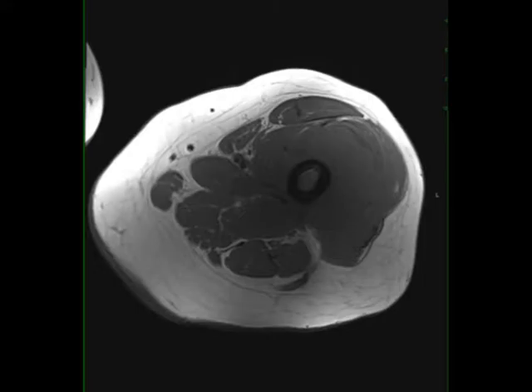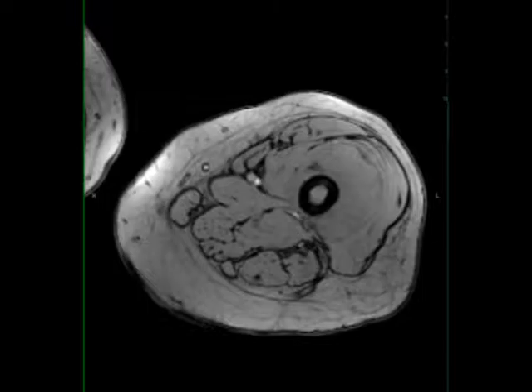This is a 45-year-old female who presents with left thigh pain and swelling. The images demonstrate an infiltrative T1 iso-intense, STIR heterogeneously hyper-intense lesion involving both the medullary cavity and cortical margin of the left femoral diaphysis with extension into the adjacent thigh musculature.